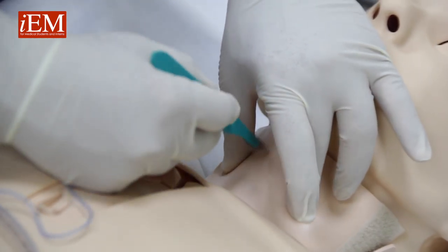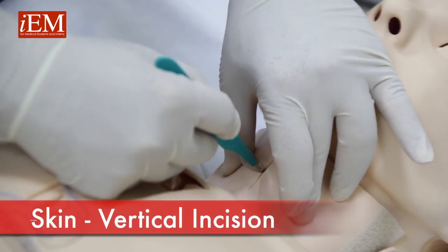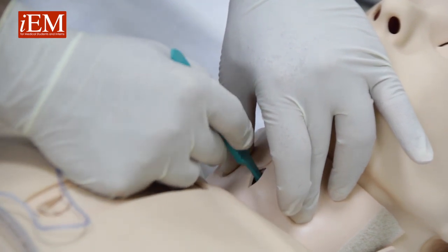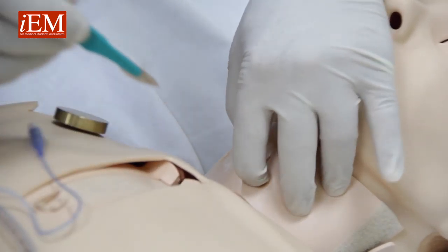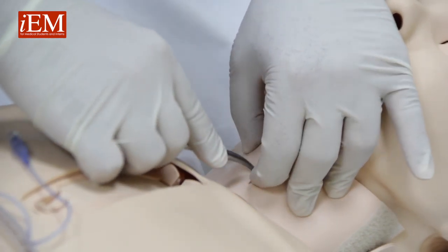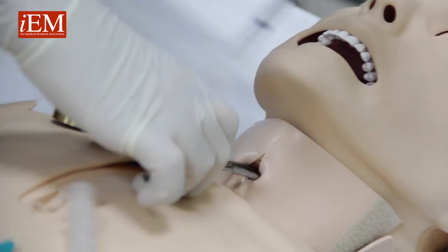Make a vertical incision over the cricothyroid membrane, then go inside and cut the cricothyroid membrane. Take your blade out, keep your finger in, insert a small Kelly, and dilate.